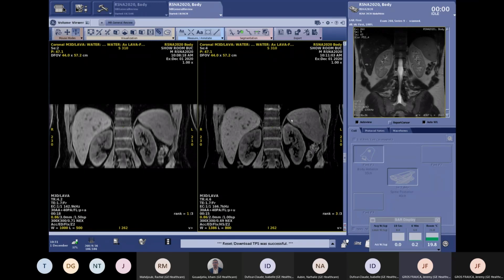So we have one last question about what could be useful for painful patients and pregnant. It's a very good question, because we recently had a case in the UK where they were using the AirCoil because none of the other coils were fitting the patient because she was really in pain. She broke her shoulder. And then we were able to cover and examine that patient very successfully using the AirCoil, because it was the lightest one that the patient could support.